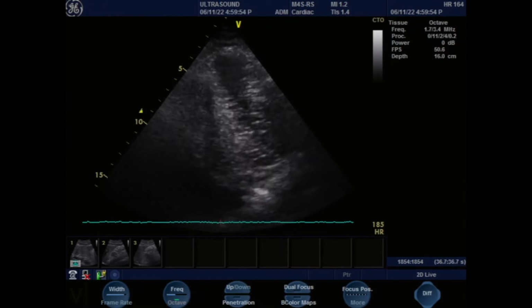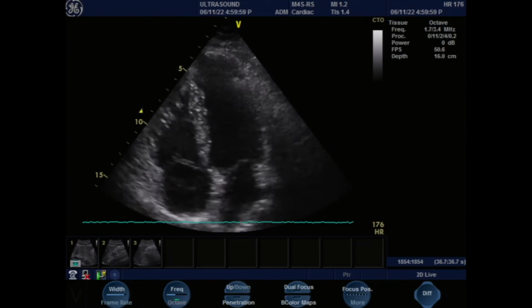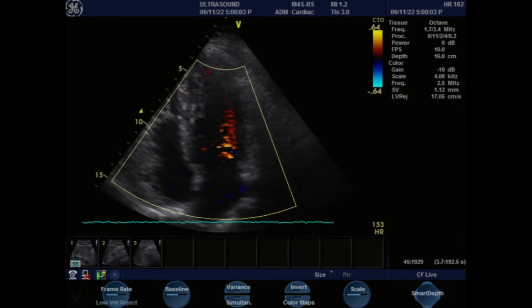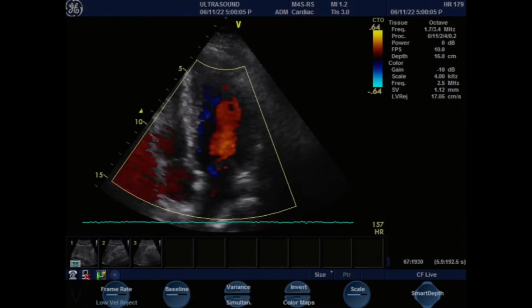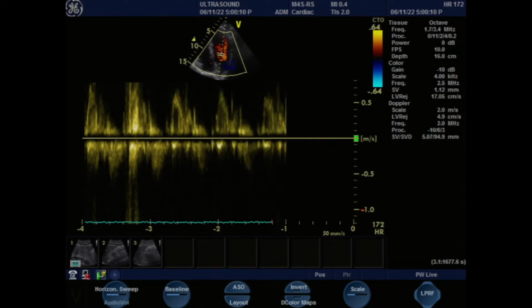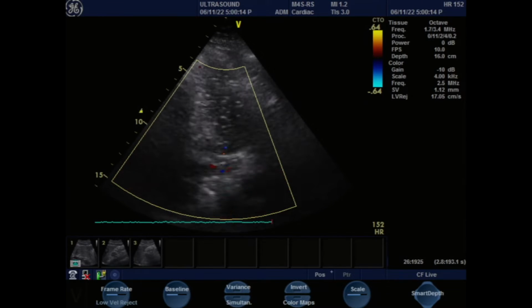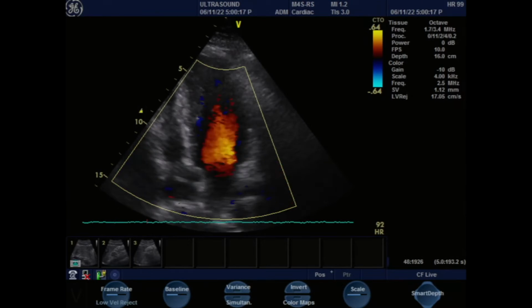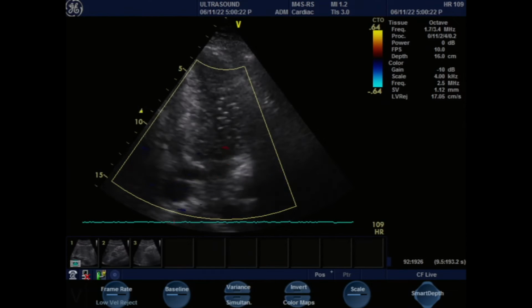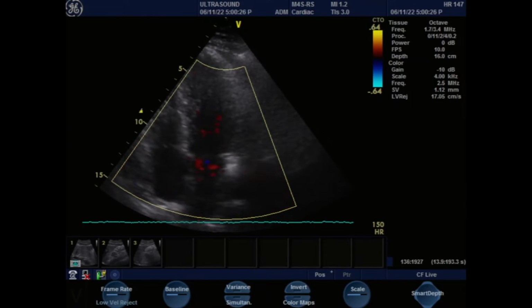And now this is a good place to start doing some color Dopplers. If you could help me, thank you. So let's put color on the mitral valve. And what the Doppler does is it uses the same principle of physics. It's just a color. So it uses the same principle of physics that if blood is moving towards your cone, there'll be a color change compared to if blood is moving away from your cone. Okay, it's the same thing when you look at stars.